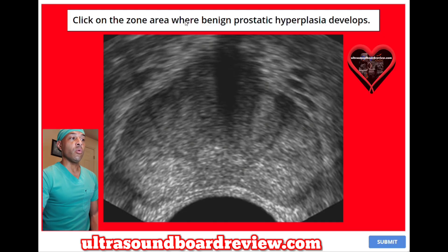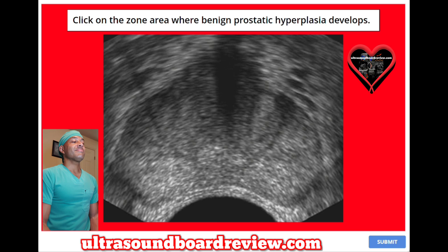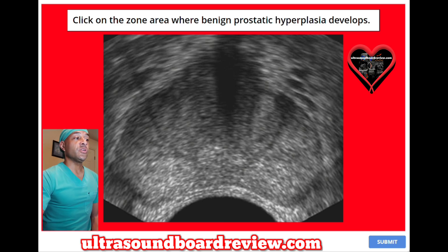Click on the zone area where benign prostatic hyperplasia develops. The answer is right in this region here. This is called the transitional zone.